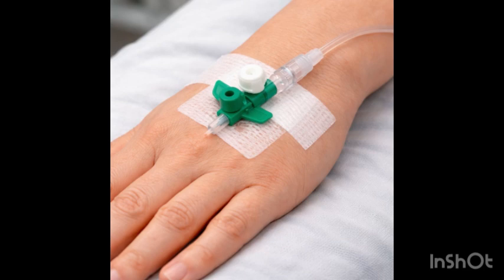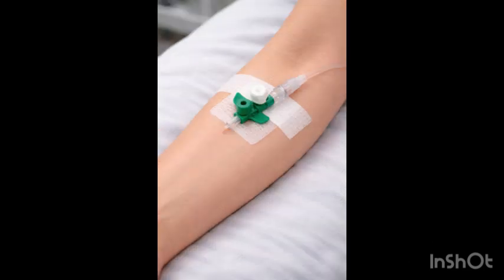It is easy to access because the veins are much more superficial, and the issue may be that you can have tortuous veins there, but anyway it is the most preferable place to place an IV cannula. The next place I'm going to talk about is the forearm. The forearm is also good. You can have both small and large veins there, and it is good for long access and much more comfortable for the patient.